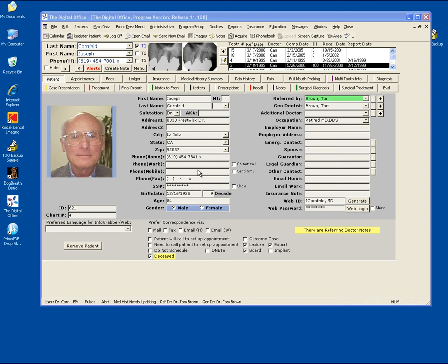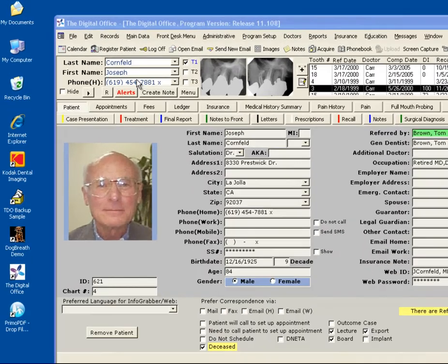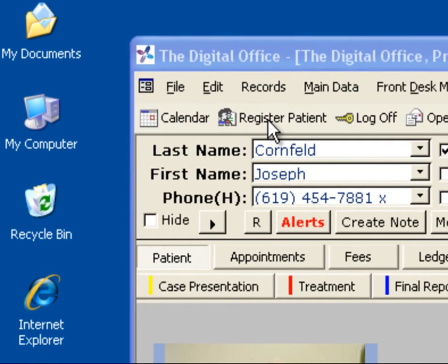To bring your postgrad cases into TDO, the first step is to register the patient into the software. To do this, click the Register Patient button on the top menu bar.